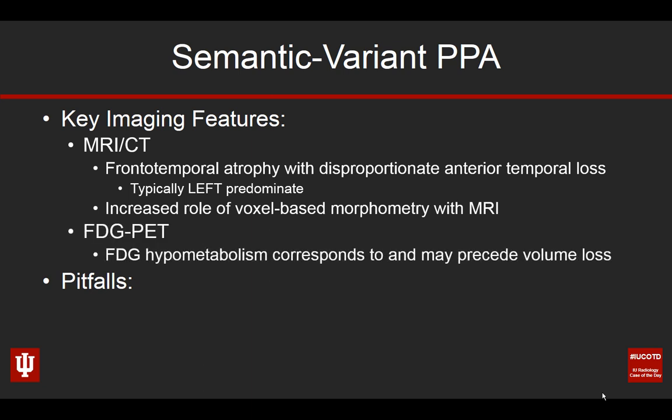And if you're doing nuclear medicine imaging, you'll see that FDG PET is sometimes used to evaluate for this particular type of dementia. And in that case, you'll see FDG hypometabolism corresponding to and perhaps even preceding those areas of left anterior temporal lobe volume loss.